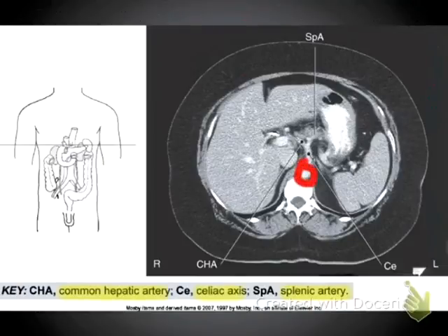And we have the aorta and something branching off here. And so we see that this is the celiac trunk. The reason we can be assured that this is the celiac trunk is we still are seeing the spleen and the liver. We're not seeing any kidneys, so we know that we're above T12. And so the only thing that should exist there is the celiac trunk.